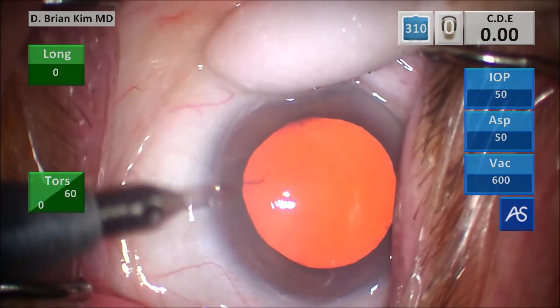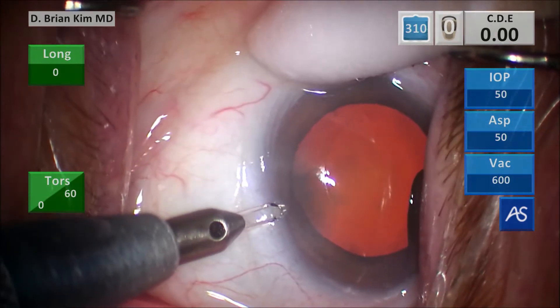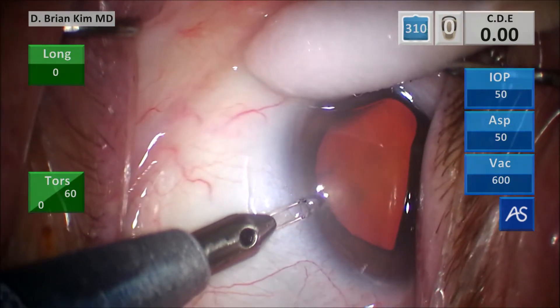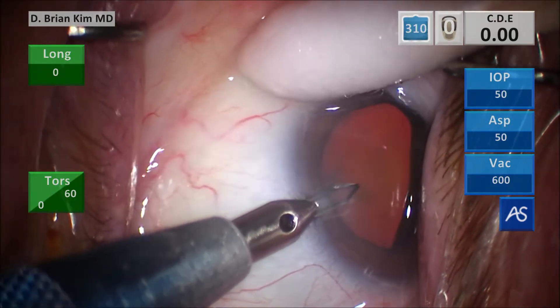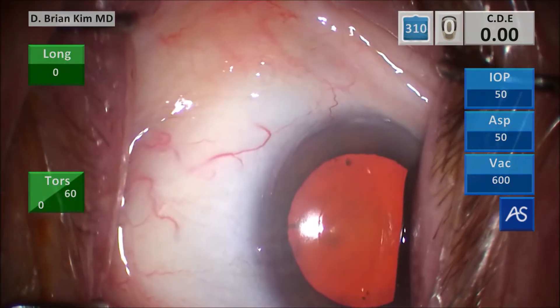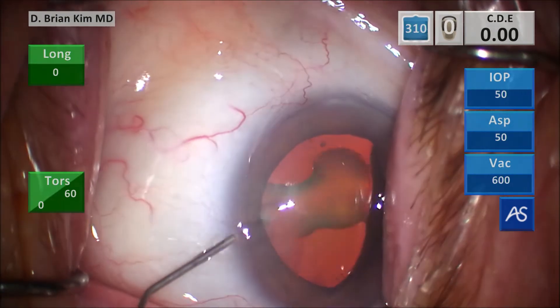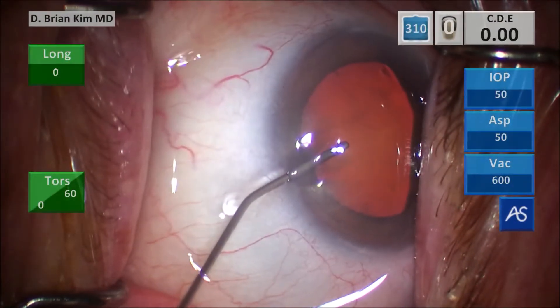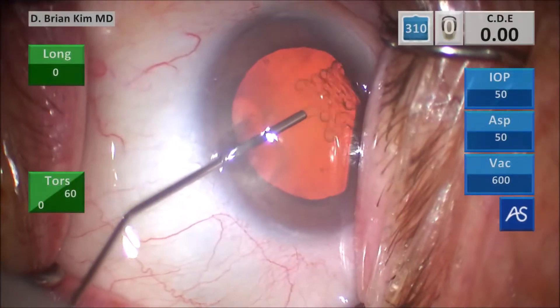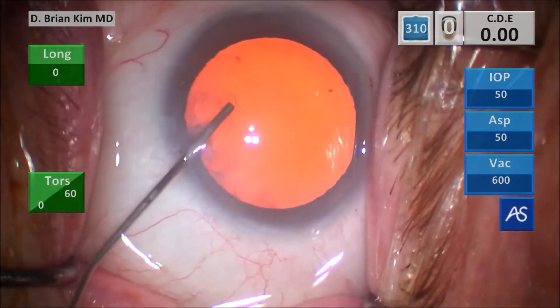You can see this patient resists my movements and has that strong Bell's reflex. I'm able to steady the eye and then make a flat approach parallel to the iris plane, which creates a nice corneal shelf and allows me to achieve a self-sealing incision. This left side is a lot easier because of the Bell's reflex. This is some intracameral lidocaine, and then some intracameral epinephrine, and then some dispersive viscoelastic to coat the corneal endothelium and flatten the anterior capsule.